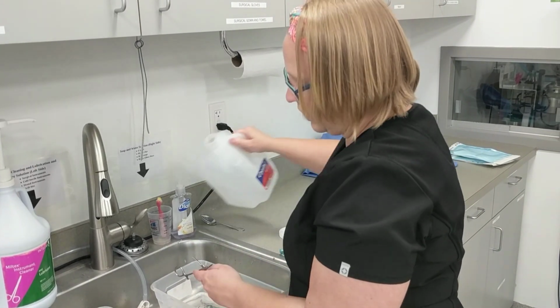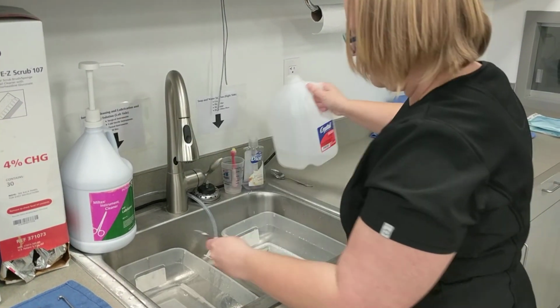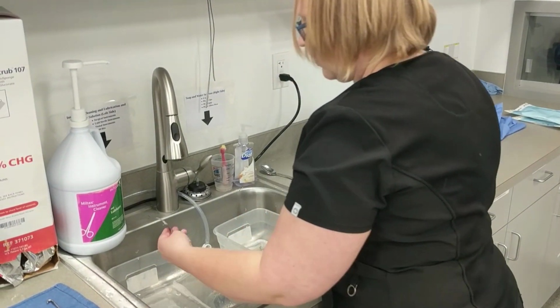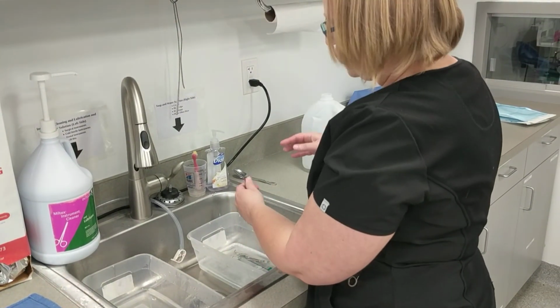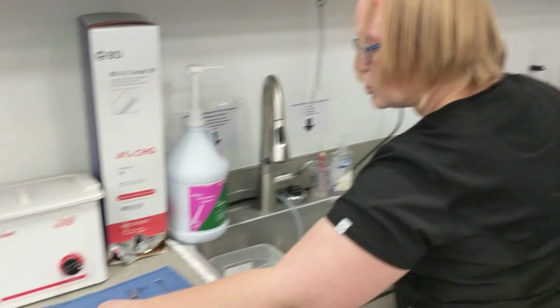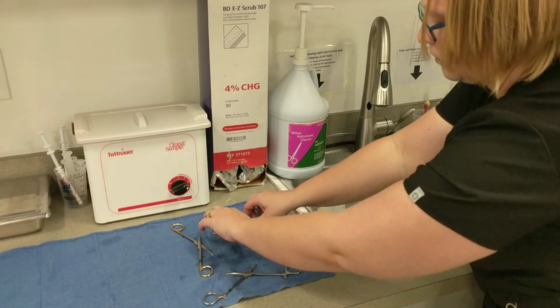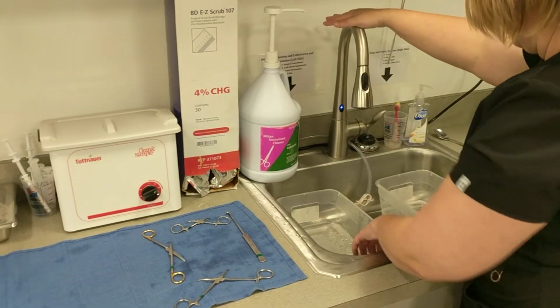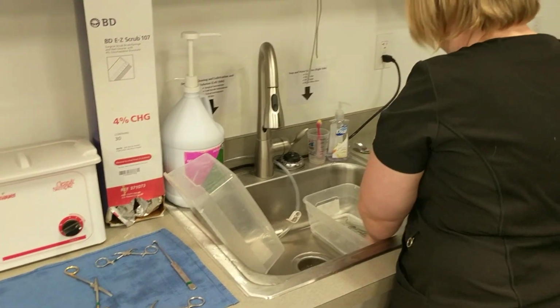Typically what I like to do is have a rinse bucket with my distilled water. Mix that right off. Most of these instruments are fairly well kept. I don't need to do that with them, but I'm going to set them out with the joints open. That bucket's not useful anymore, so I'm just going to set that there.